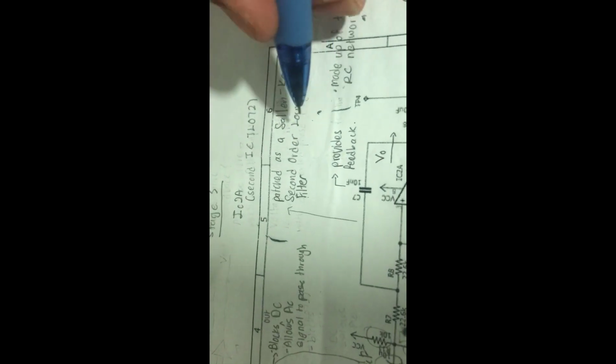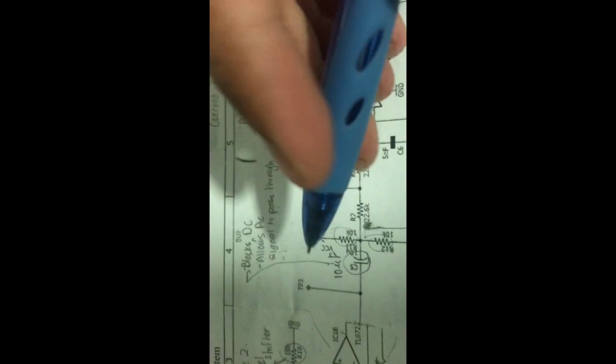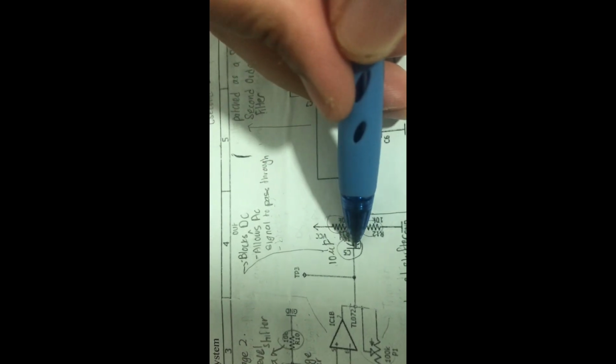Okay, so now we are looking at stage 3. This stage 3 uses a second IC, which is a TL072. It's another IC too. So IC2A, the second IC, is the TL072. This is configured as a Sallen-Key second order low pass filter. Okay, so let's see this part by part. C5 here is a 10 microfarad capacitor which blocks out DC and allows the AC signal to pass through.